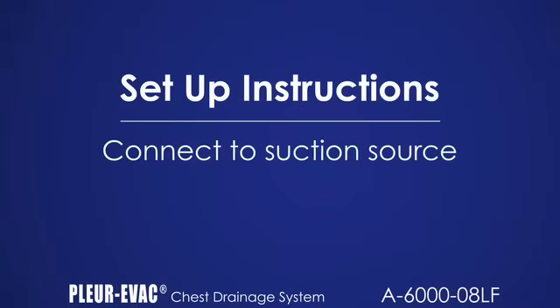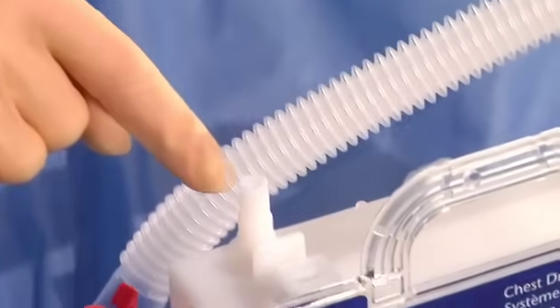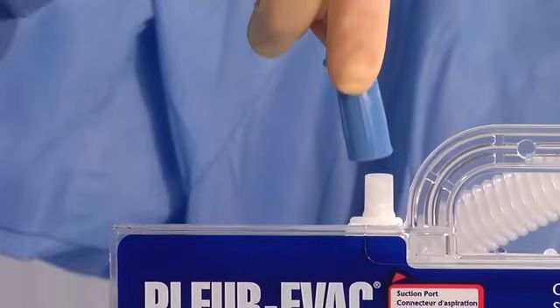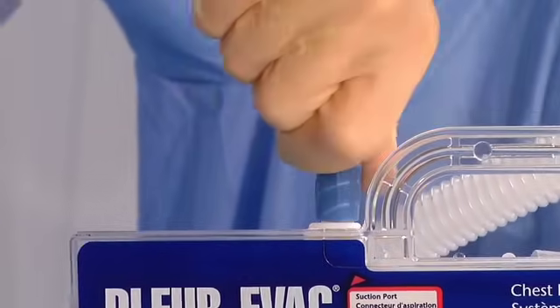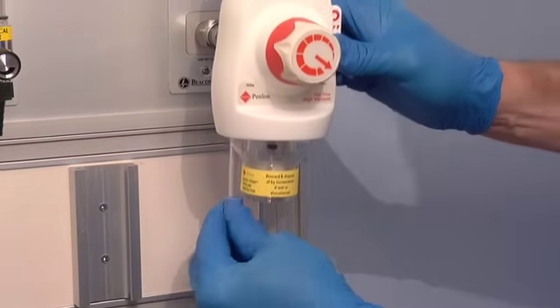In case of gravity drainage, omit the suction step. Be sure the suction port is uncovered. If suction is prescribed, simply connect the suction tubing to the suction port on the Plurivac drainage unit. Attach the other end of the suction tubing to the wall source.